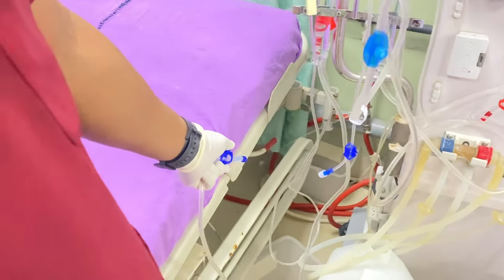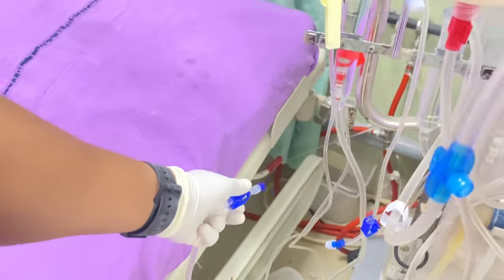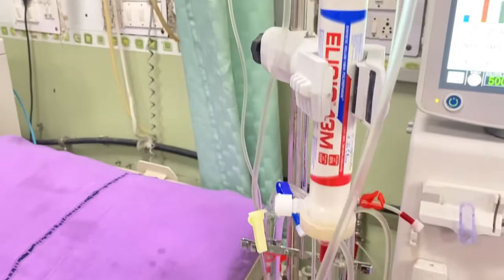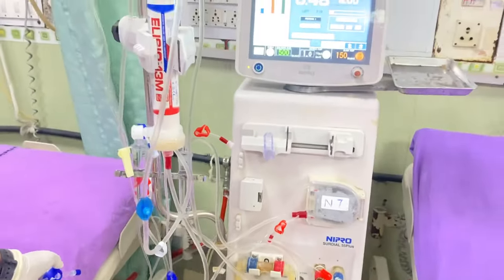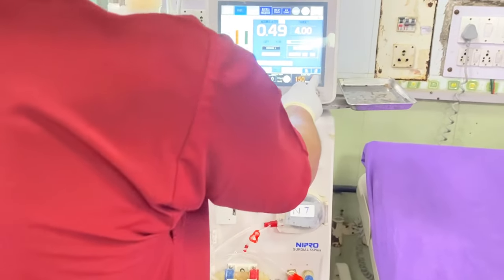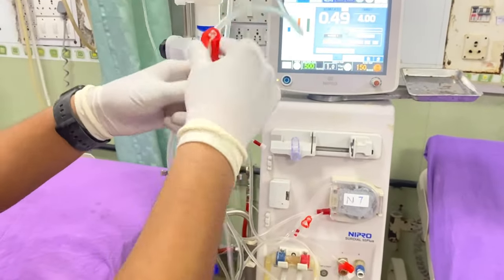Always remove at least 400 ml of saline from the circuit, because as you all know these tubings and dialysers are sterilized by ETO, which is a chemical that is harmful for the patient. So always remove at least 400 ml of saline from the dialyser tubing. Now we can stop the blood pump and connect the artery line and venous line together.